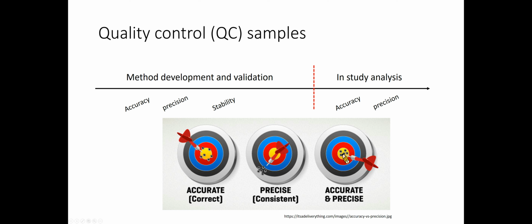You should prepare the QC sample in the same matrix as the study samples to be assayed with a validated method. Freshly prepared QCs are recommended for precision and accuracy analysis during the method development, as stability data are generally not available at this time.